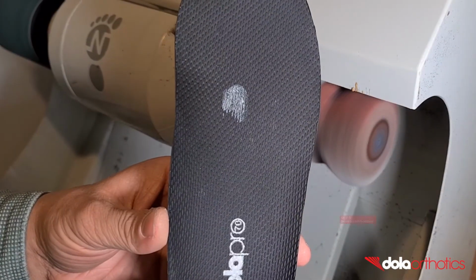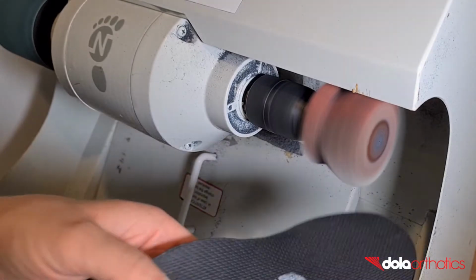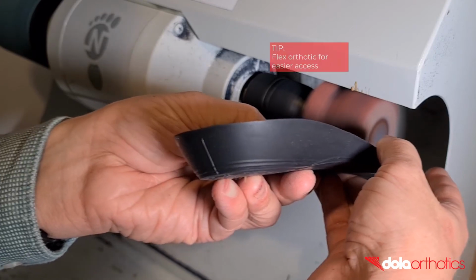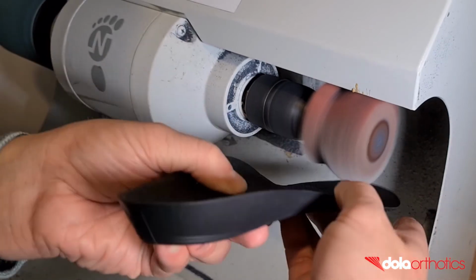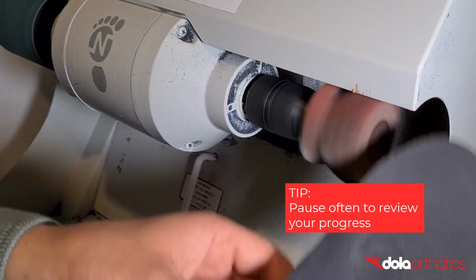The aim of grinding is to remove the orthotic shell material at your mark to the depth required. Holding the orthotic shell medial and lateral to the grinding area, place the dorsal surface of the orthotic shell against the edge of the grinder. Flexing the orthotic will allow easier access to your grinding mark and will protect you from grinding unwanted areas including the heel cup. Remove small sections of the orthotic at a time until you become comfortable and check your progress.